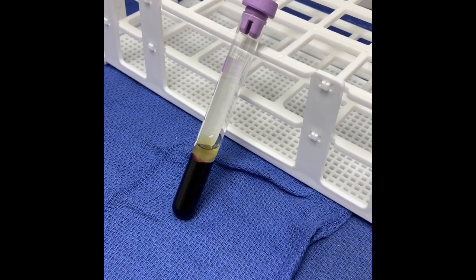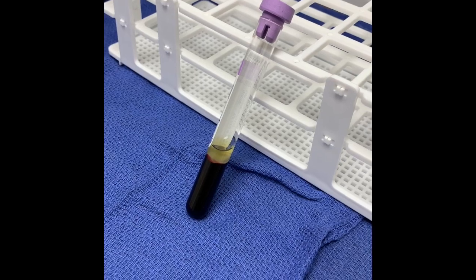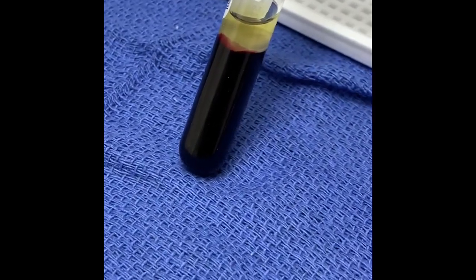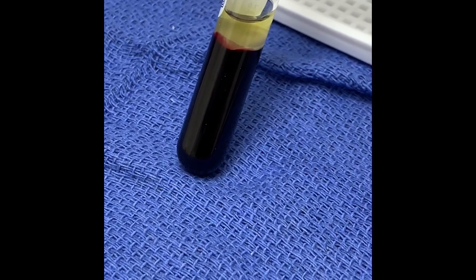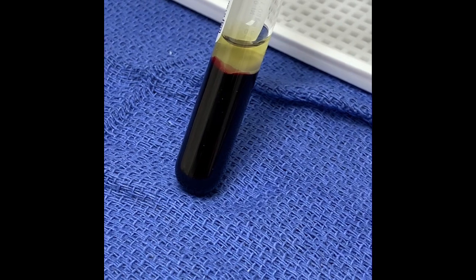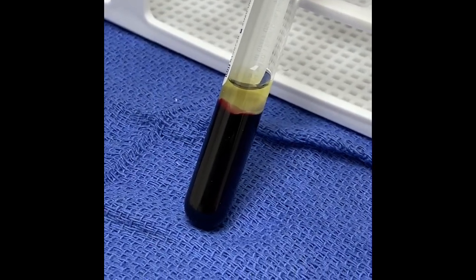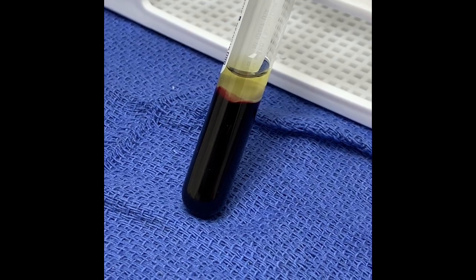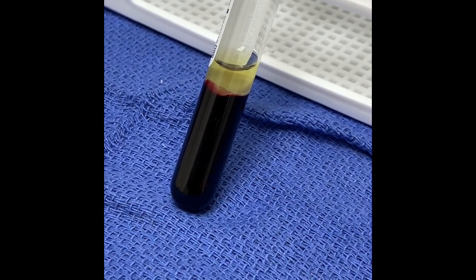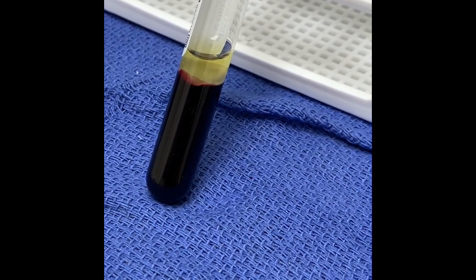And basically, as everyone can see, after we spin the blood, it separates into 2 components. You have the top portion, which is, in this particular case, what's left, the PPP, the poor platelet plasma, and then we have the other component, the blood, on the bottom. So that's how it separates, and then we're able to isolate the PRP, the rich, not the poor, right?